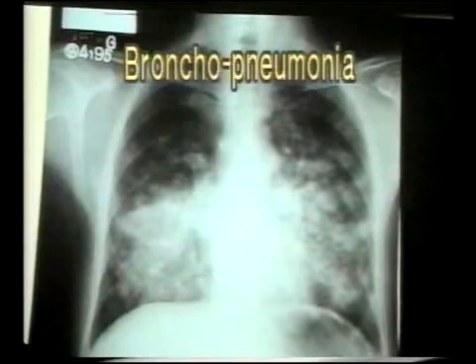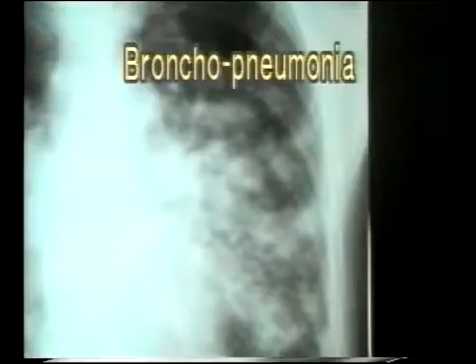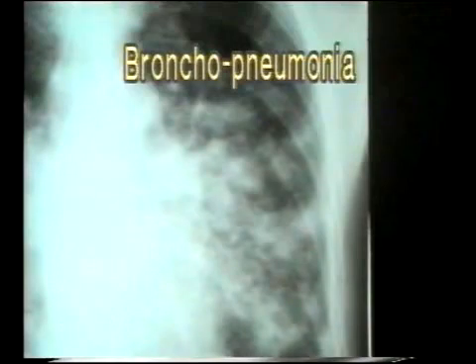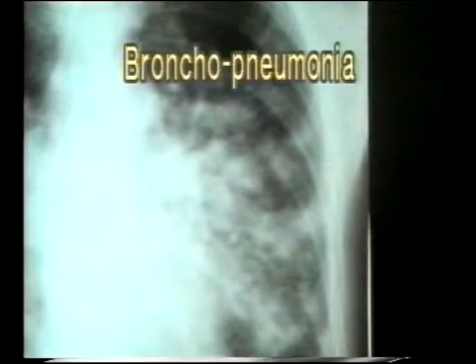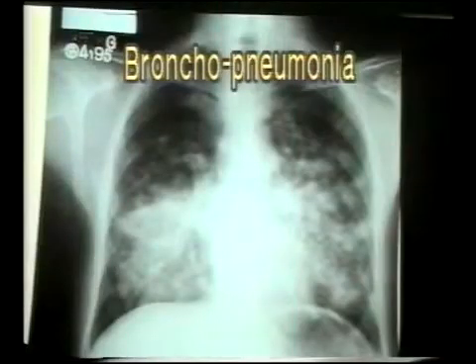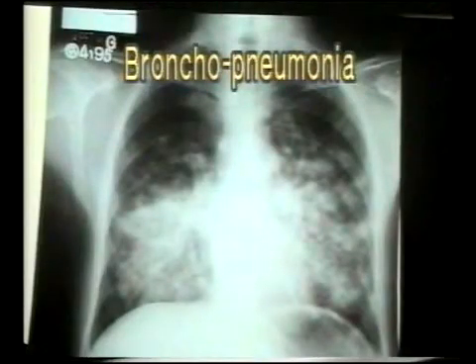This X-ray picture shows patchy consolidation, which is not restricted to a particular lobe or a particular segment. Note in the X-ray that the mottled opacities are of varying sizes, mainly in the lower zone and more on the right side.